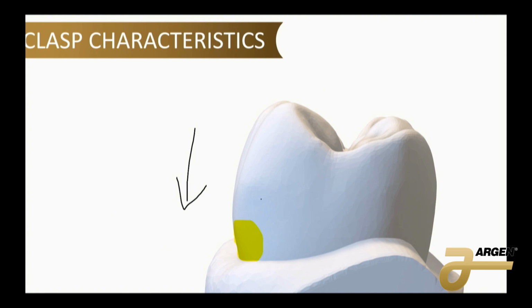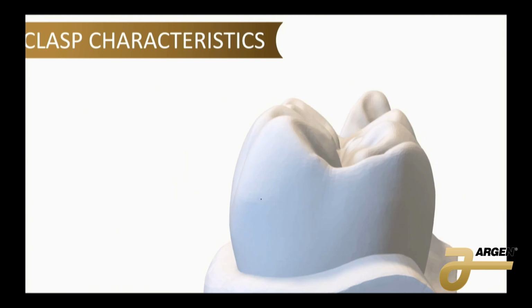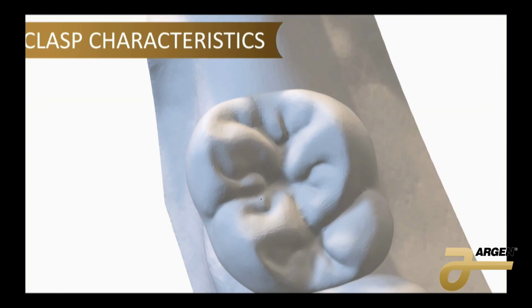So in those situations, you don't want a short, wide, uniform thickness clasp. You want something tapered, something that's a little bit thinner, not too thin, so it can get that flexibility of material. Otherwise, it's going to be too rigid and it's just going to scratch the tooth. It's going to hold on too tight, cause forces that we don't want. Now, because we have a clasp that is bending around our tooth, that means that we're pushing forces onto that tooth.